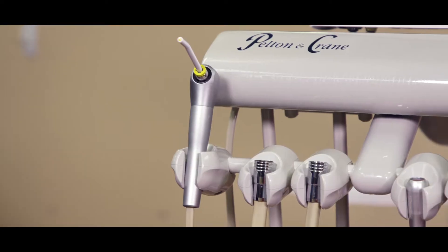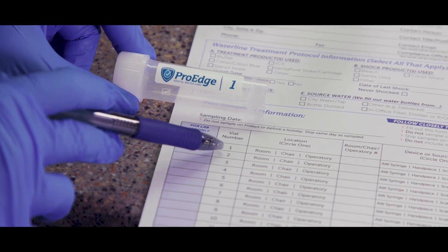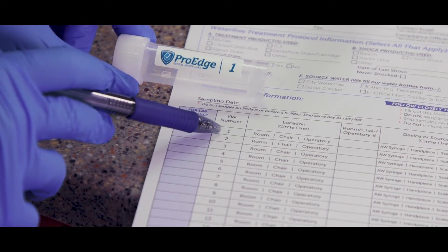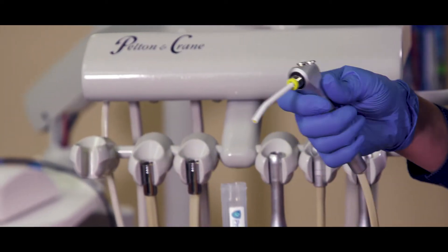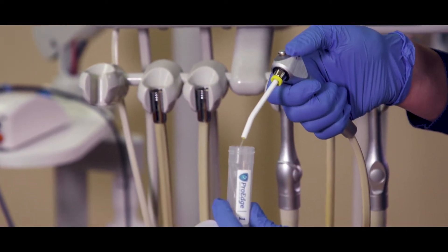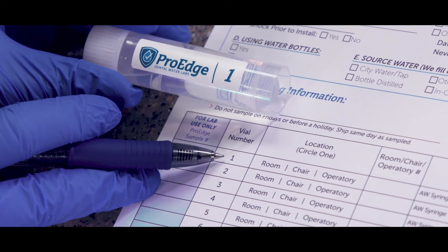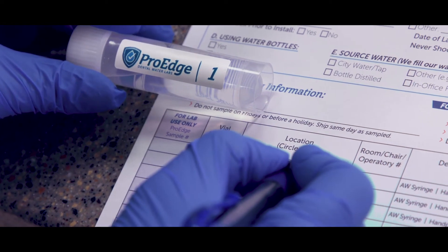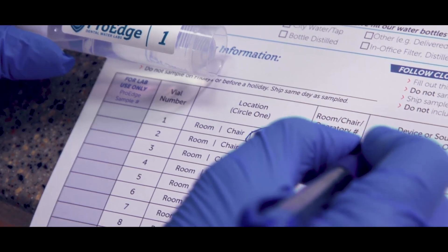Next, begin taking water samples directly from your dental unit water lines, matching the numbers on the vial labels with the vial number on the submission form. For example, taking the first sample from the air water syringe in operatory 4, match the number on the vial with the corresponding row on the form, circle the vial operatory, make a note that it's operatory 4, and circle air water syringe.